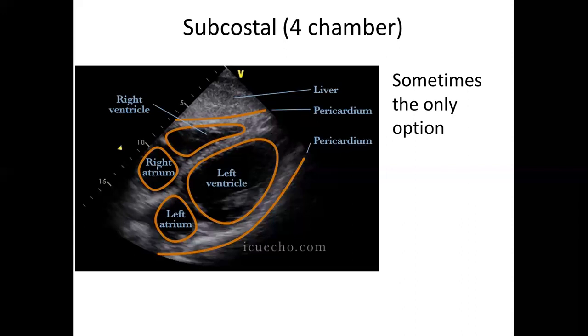So as an example, a patient may have emphysema and enlargement of the lungs, and as a result you will have the heart covered with lung tissue excessively, and that's why you cannot put the probe into the intercostal spaces, because these areas may be covered with lungs, and lungs contain air, and air will dissipate the ultrasonic beam.